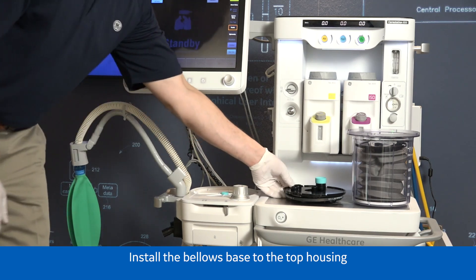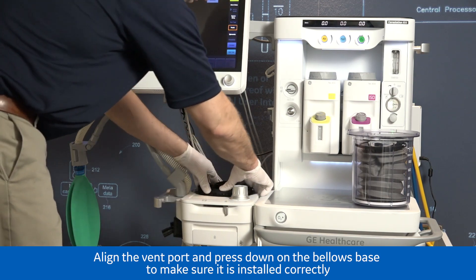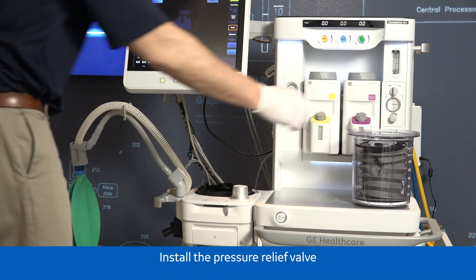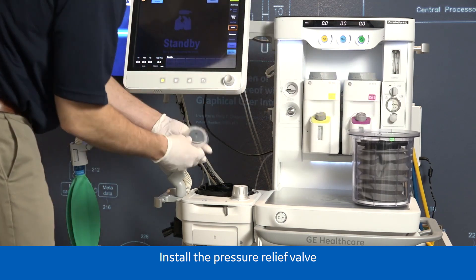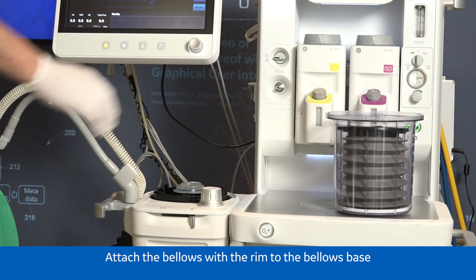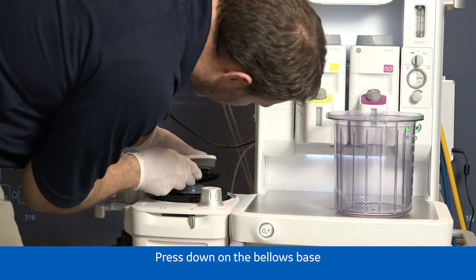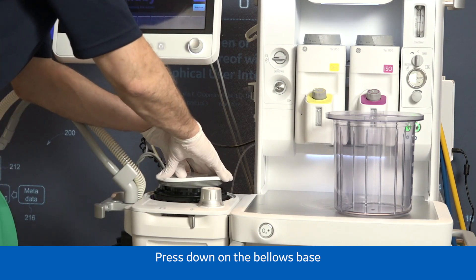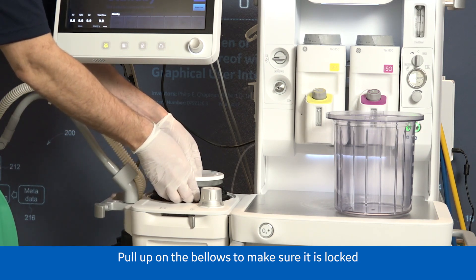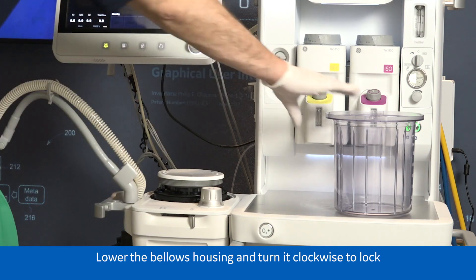Install the bellows base to the top housing. Align the vent port and press down on the bellows base to make sure it is installed correctly. Install the pressure relief valve. Attach the bellows with the rim to the bellows base. Press down on the bellows base — a double click should be heard when the rim is installed. Pull up on the bellows to make sure it is locked. Lower the bellows housing and turn it clockwise to lock.